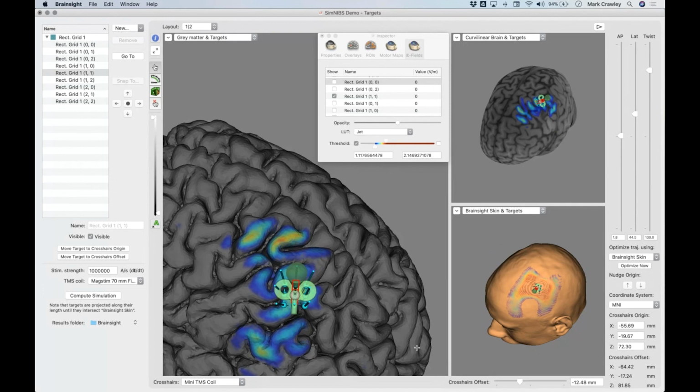On that as well then, Rory, we could also add the Mikkelsen 2018 paper, which also has something to bear in mind when doing TES simulations: the position that someone was scanned in. Typically, someone will be scanned lying down, and they'll be stimulated in a prone position or sat up.